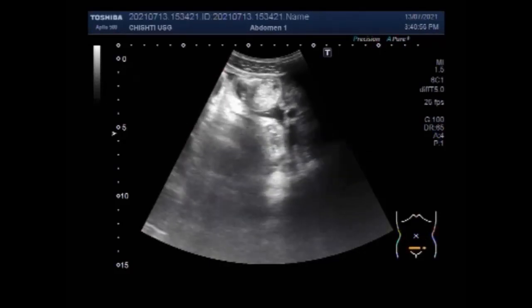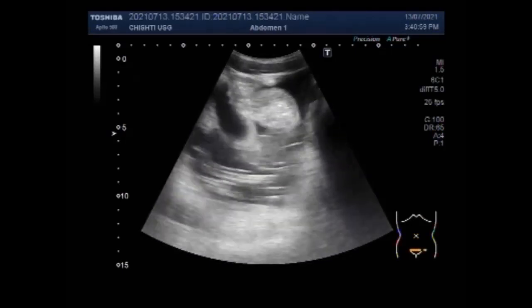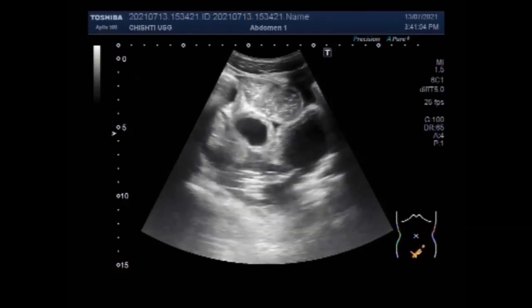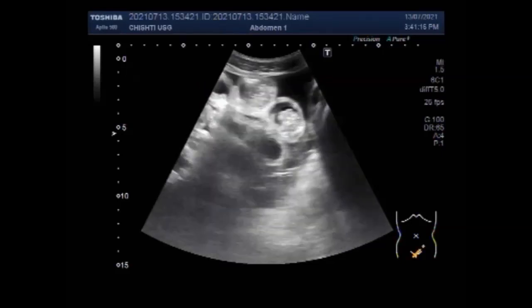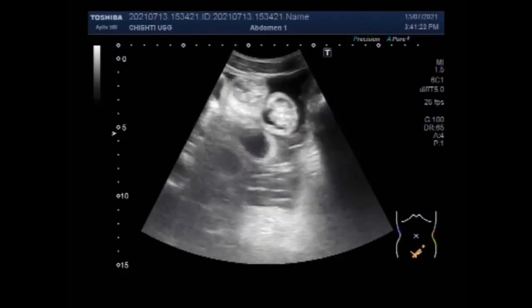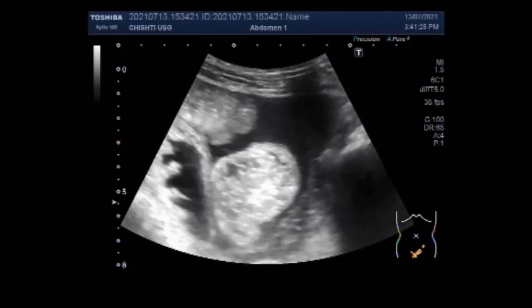Now you can see the free fluid is seen in the lower abdominal cavity. The CT scan can also help to locate the possible holes, then there is a blood test, and the first step was the X-ray of the chest.